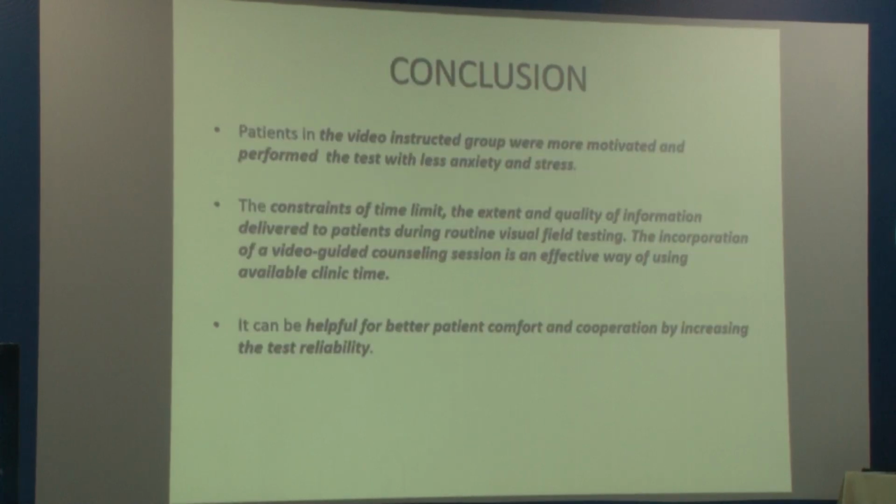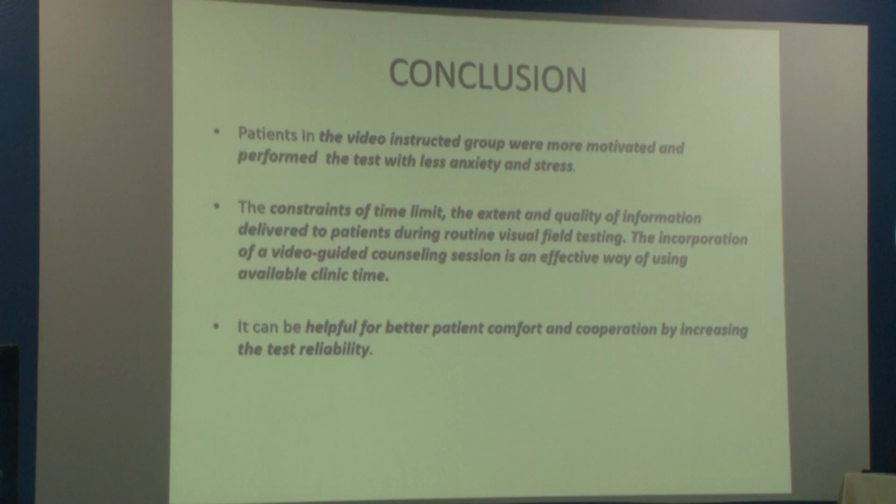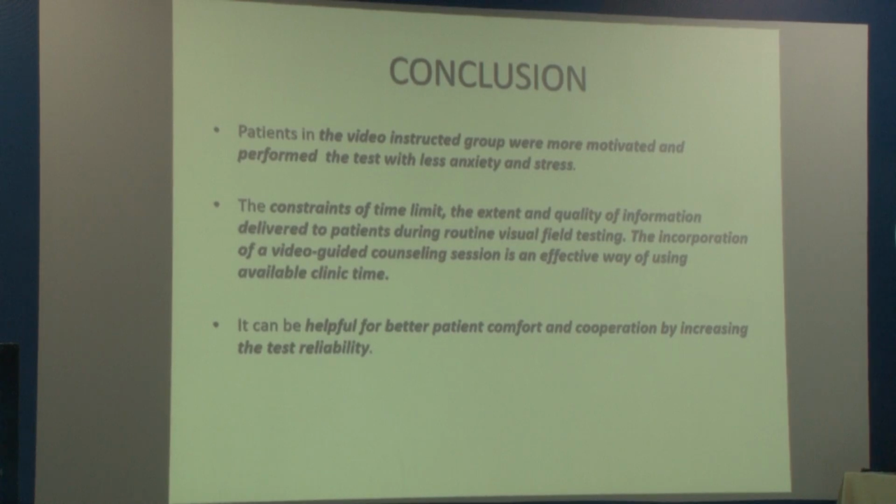So to conclude, the video instructed group were more motivated and performed the test with less anxiety and stress. And given the time constraint that limits the extent and quality of information delivered to the patient during routine visual field testing, the incorporation of a video guided counseling session is an effective way of using available clinic time. And it can be helpful for better patient comfort and cooperation by increasing the test reliability.